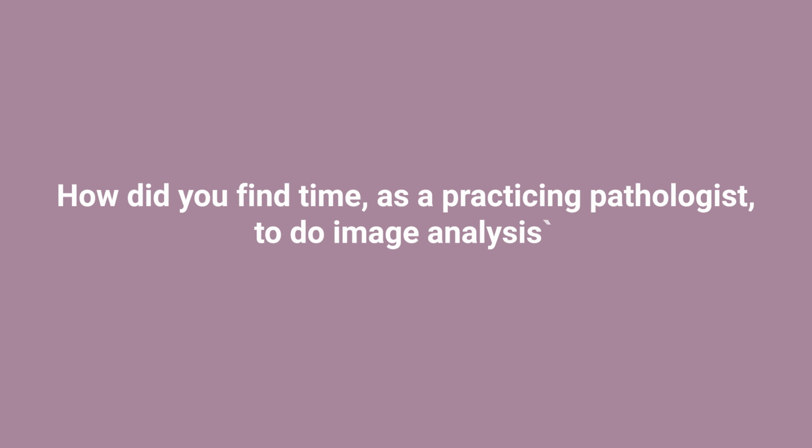So how did this start? How did you even find time as a practicing pathologist to do image analysis? Like, what were the circumstances?